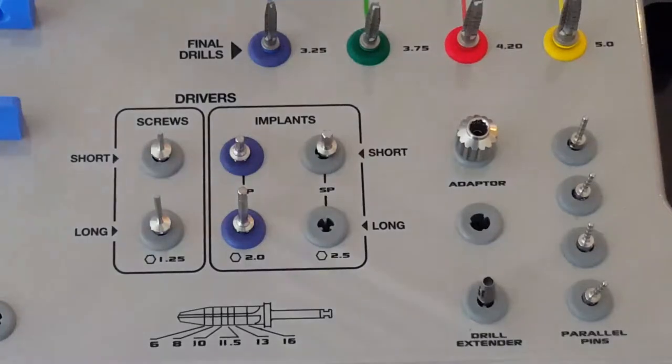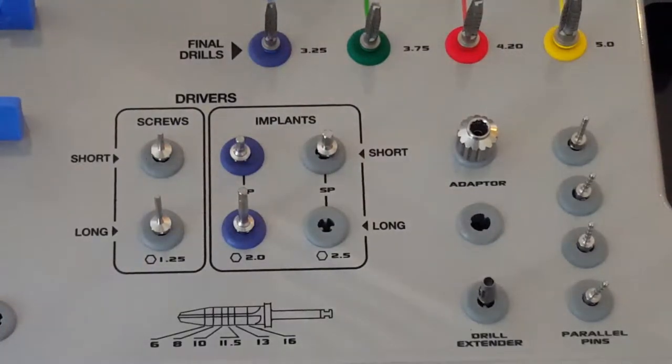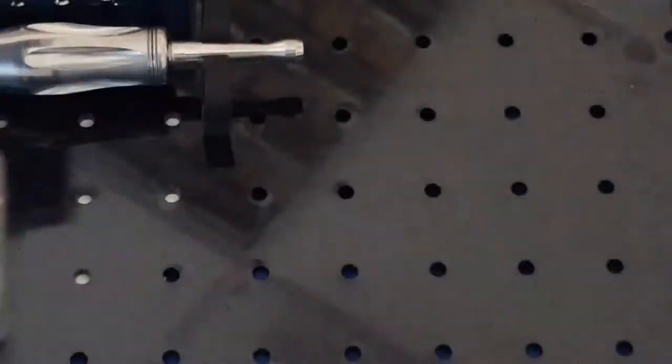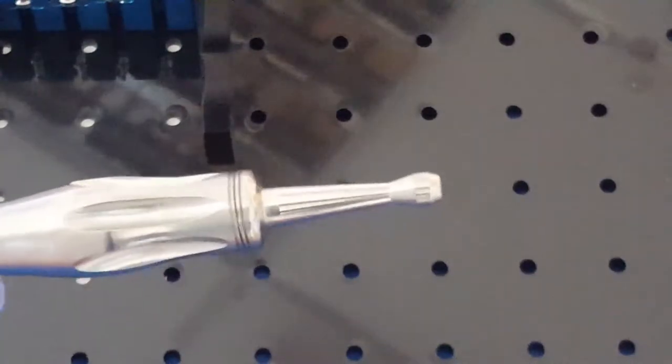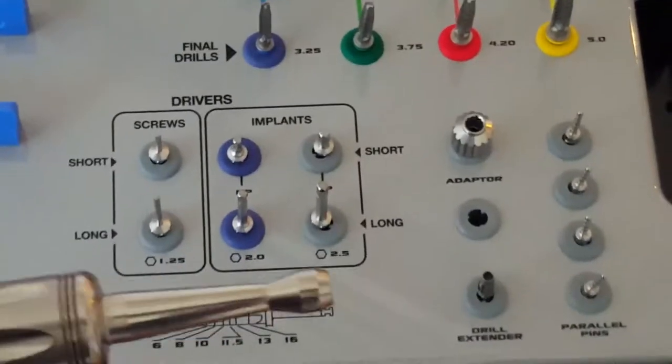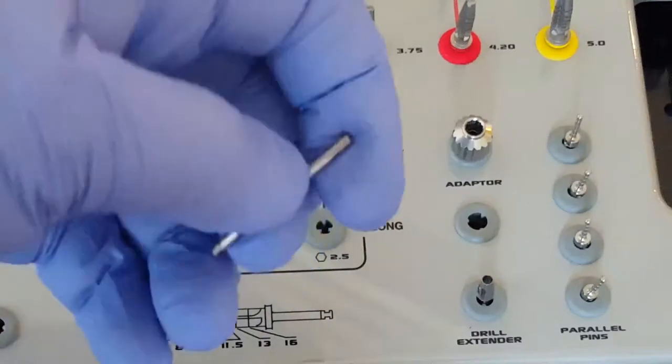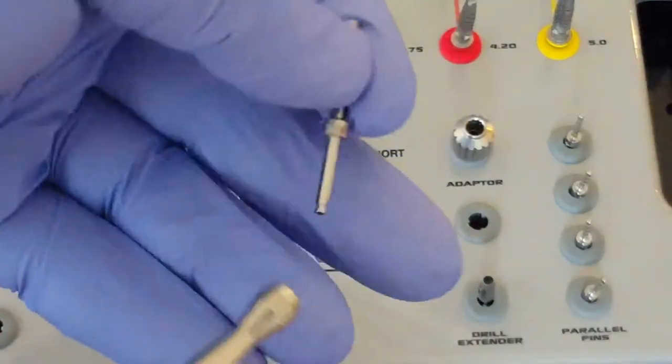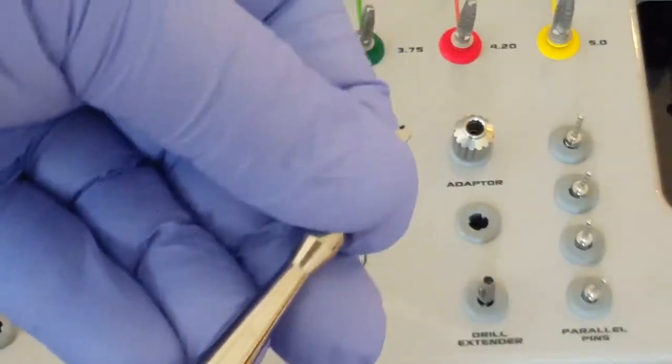We can also utilize one other device to insert the implant, and that's utilizing the hand driver, again, which is in the base of the tray. In the base of the tray we have our hand driver, and I can take the implant insertion key. I'm going to slide it into the driver.